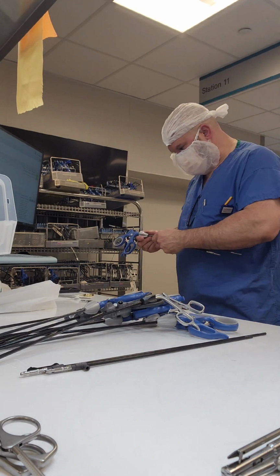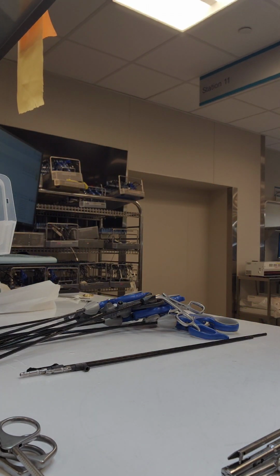Now I did find the sleeve that I was looking for, and now I'm going to look for the 2 instruments that are single use. Now notice how long it takes me to find these instruments. I don't have a stopwatch with me, and I don't know what the time is right now, but it was probably a minute or 2, maybe longer than that. Yeah, I'm back there looking. I knew exactly where they were at, but the way we store it, there's always better ways to do things. We store it the best way we possibly can.